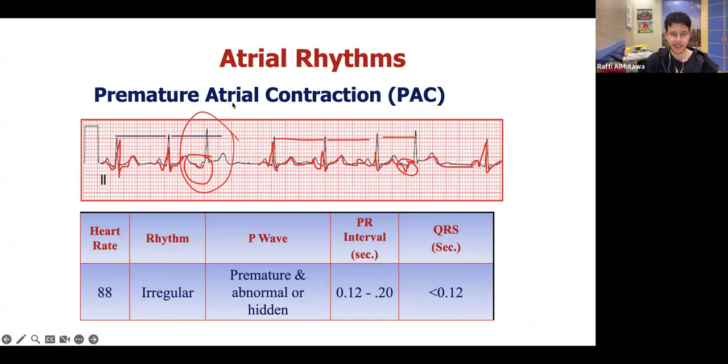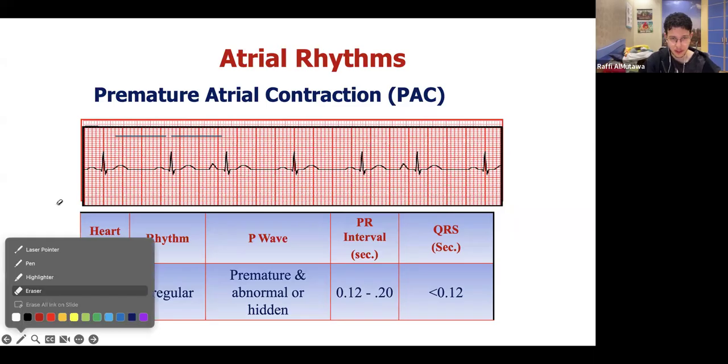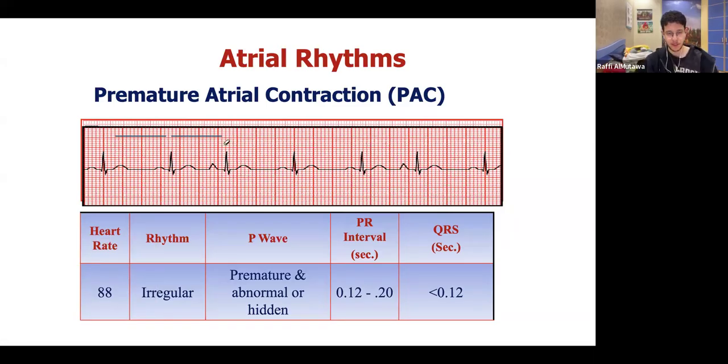Okay, that's fine. Let's go back. Let me try to explain this in another way. Let me clear these. Maybe this will be a little bit clearer. I understand this part's pretty confusing, to be honest. Okay, so let's go back. No, I don't want the eraser. Okay, let's go back.